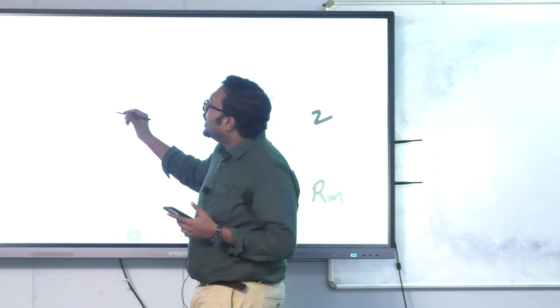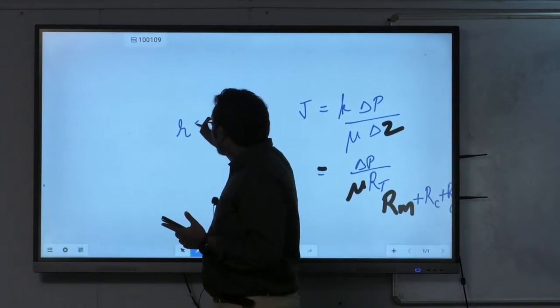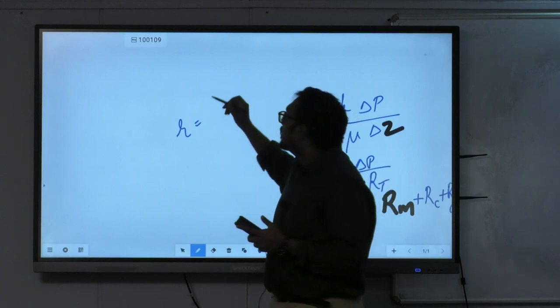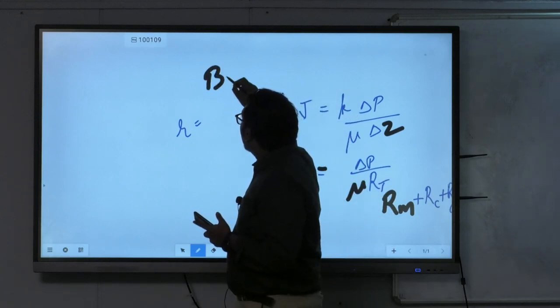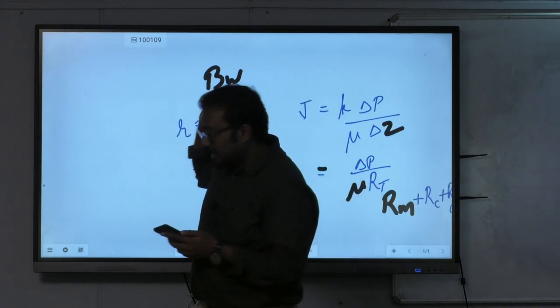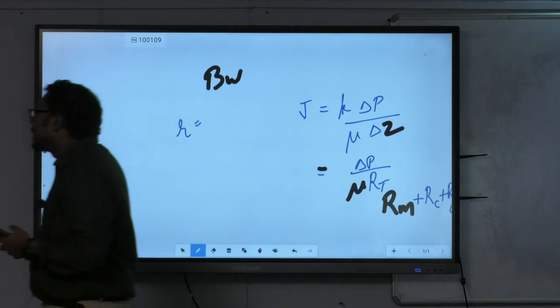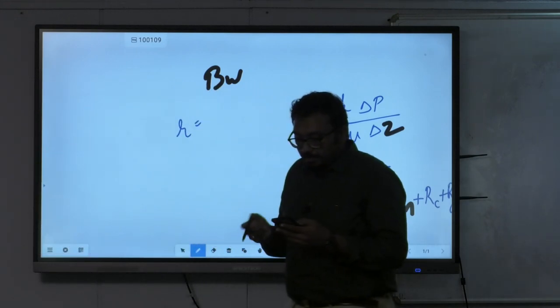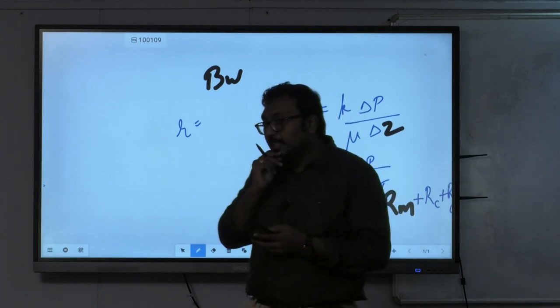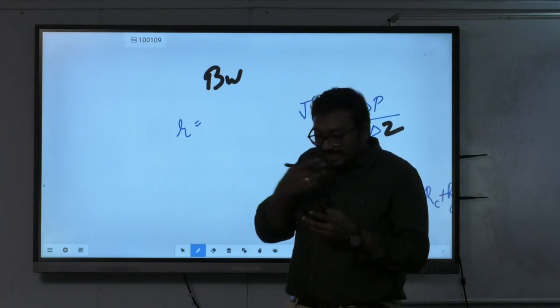And you can find your radius, right? By slowly increasing the pressure, you can find your bubble point and pore size distribution. So you have both the intrusion porometer or mercury porosimetry, whatever. Then selectivity, how do you determine selectivity? So that is the first part. How do you determine pore size? How do you determine selectivity?